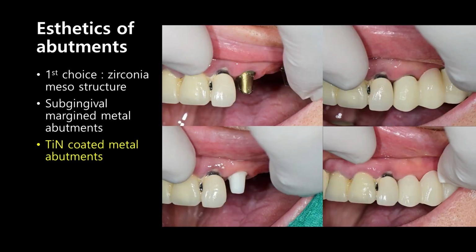Inevitably, this is my patient, and of course, to the patient on the anterior side, I ask whether he wants zirconia abutment or general abutment. Let the patient choose. Of course, zirconia is a bit more pricey, but here gold temporary was used and slightly gold color was exposed. So we switched to another abutment because the patient did not like it. And abutment was a bit showing, but aesthetically it was okay.